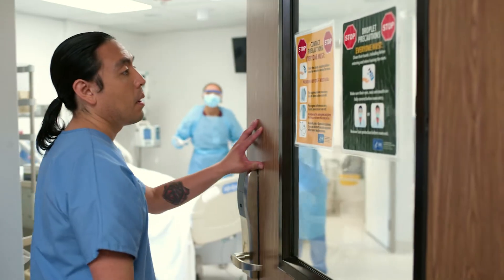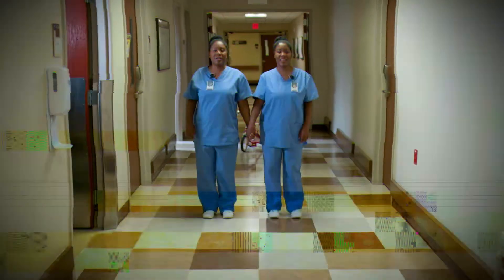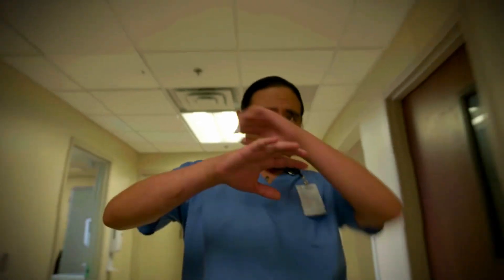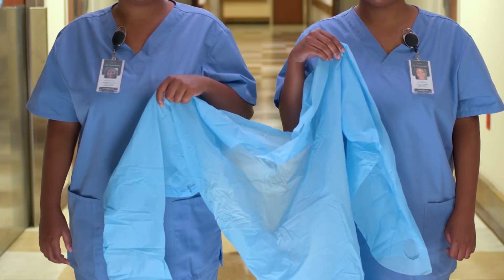PPE. Hello, Sam. Did you forget something? We have something to show you. Come learn with us. Personal Protective Equipment, AKA PPE.